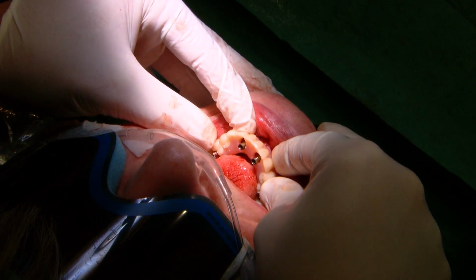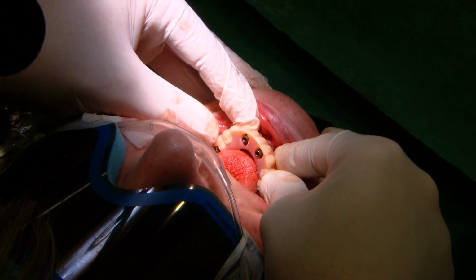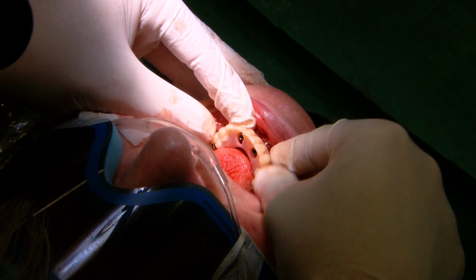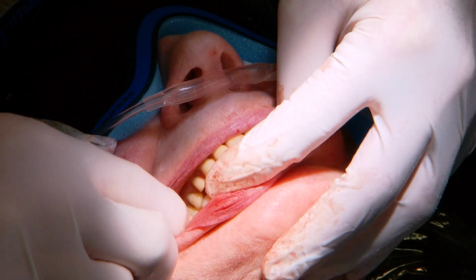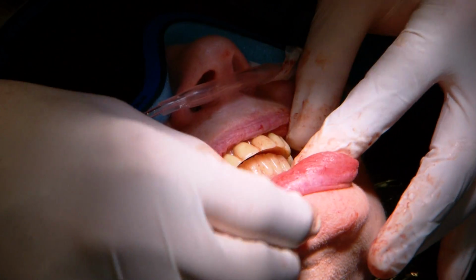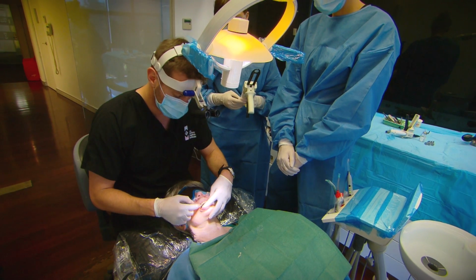So now the surgical guide fits over our cylinders, and as we predicted, we will have our cylinders close to our screw holes, as close as we can to these lower incisors, and coming through about the last molar. Perfect. We've attached temporarily. We've attached the bridge to the 4 cylinders. We've got them in just about the right bite and right position.